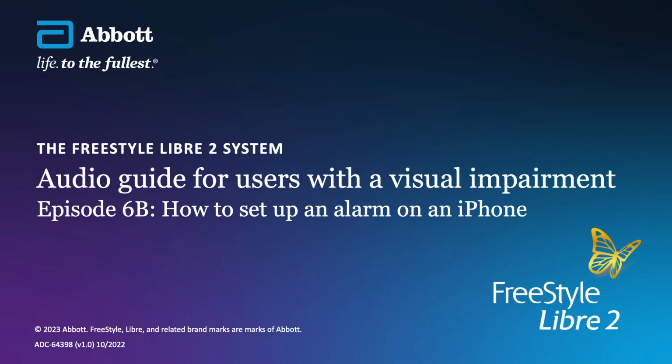How to set up alarms on an iPhone. In order to use the alarms on your phone, Bluetooth must be switched on before starting your sensor. Your phone must then be kept within 20 feet of you and unobstructed in order to maintain contact with the sensor.